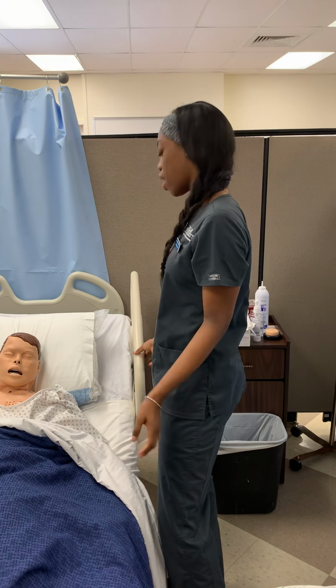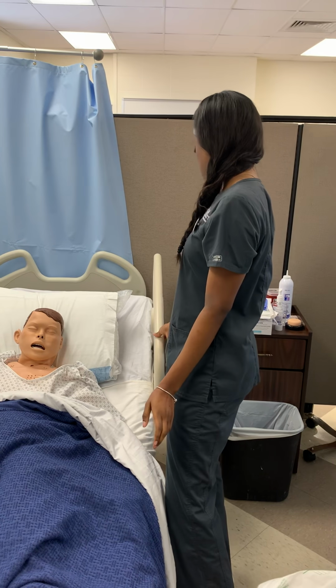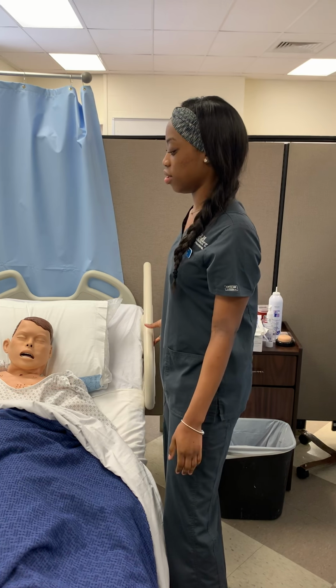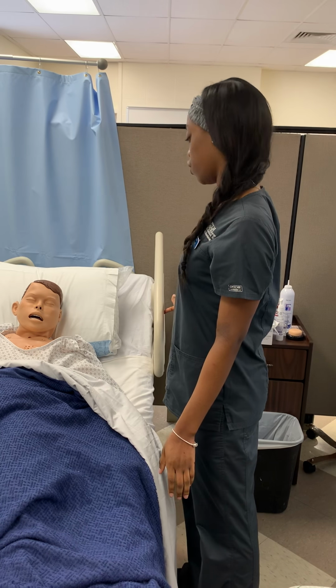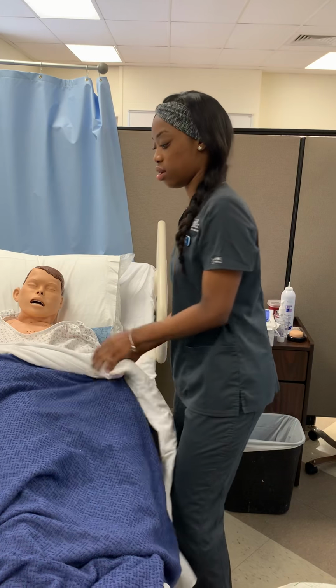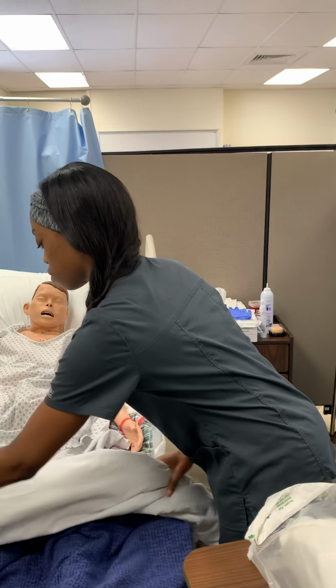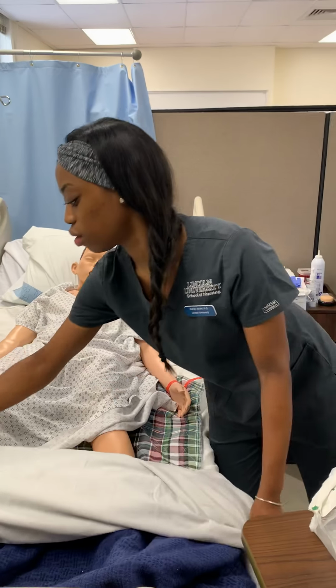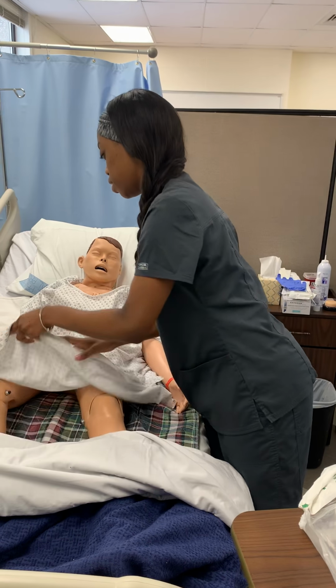Before I start, I will perform perineal care to make sure everything's clean. I'm going to raise the bed to my waist level for good body mechanics. Now I'm going to pull back this cover, and I'll let the patient know to tell me if he feels any type of discomfort.